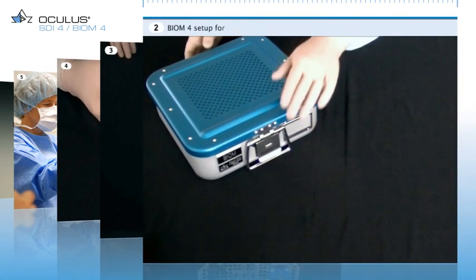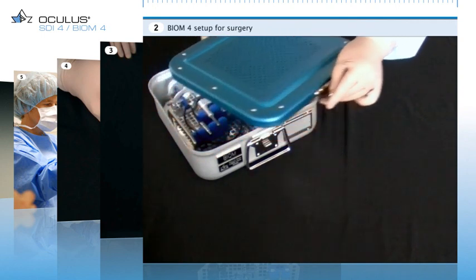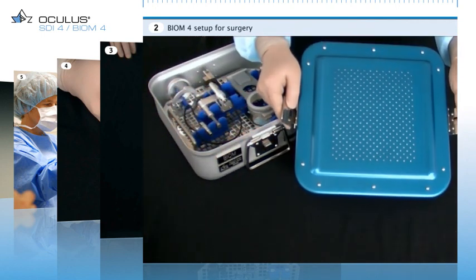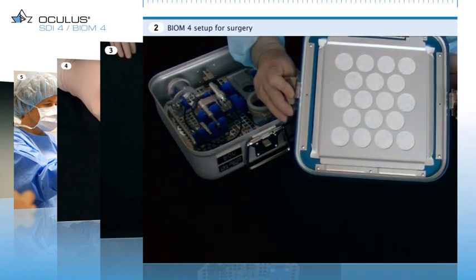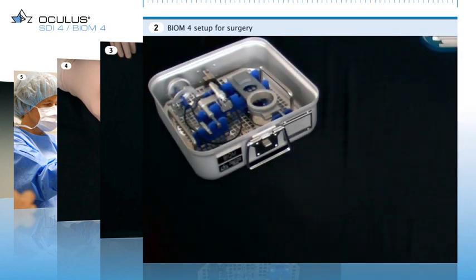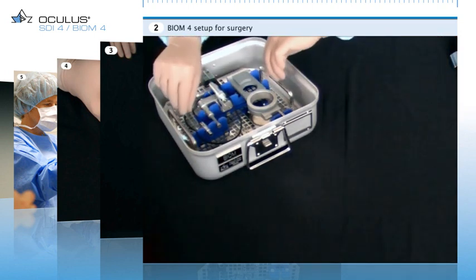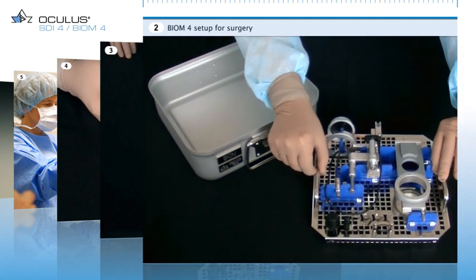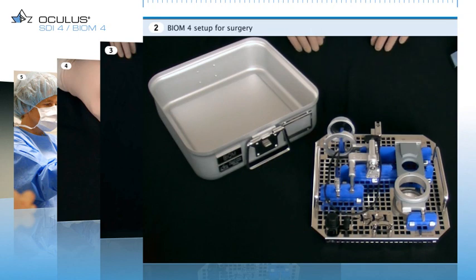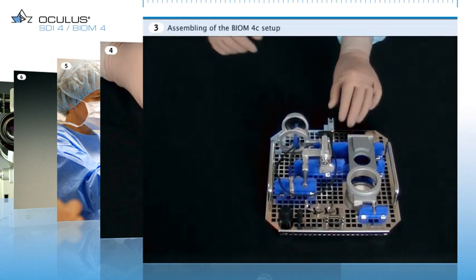Information and guidance on the use of the Biome 4 Wide Field Observation System for posterior eye surgery. Open the steam autoclaved sterilization container and take out the sterilization tray. Now you see all the components of a complete Biome 4C set. The Biome will now be set up for use in a surgical procedure.